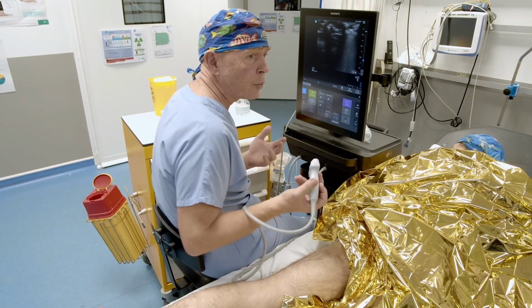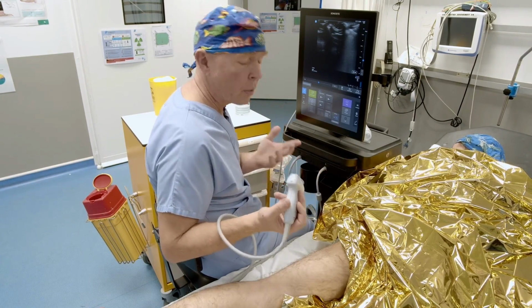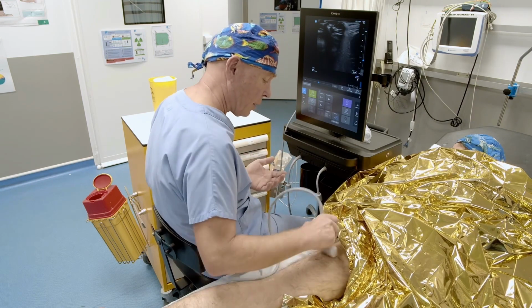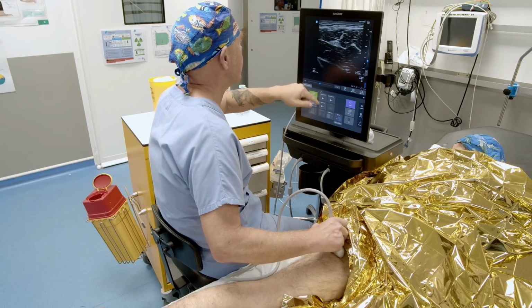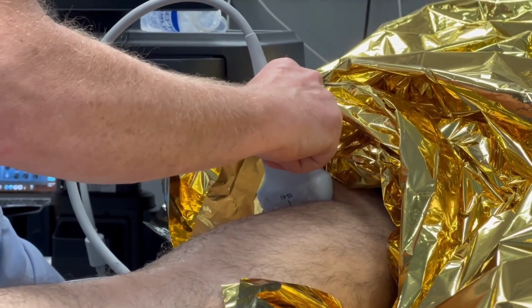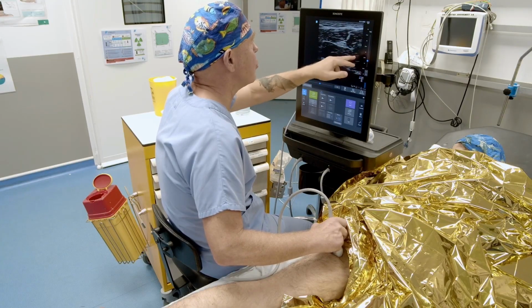The same goes for the workshop. You can also practice the sciatic block on a volunteer. So for the sciatic block, using the subgluteal approach, you place the probe, here, a bit on the external side. And you can see here that we have a perfect image of what we saw earlier with the appearance of the sciatic nerve. So there you go, we can position it very well. Actually, at the subgluteal level, it's not that far.